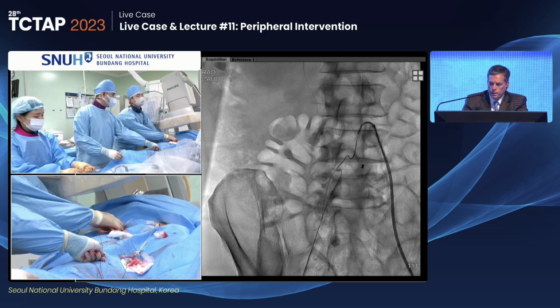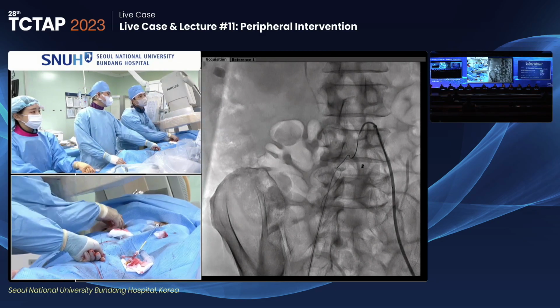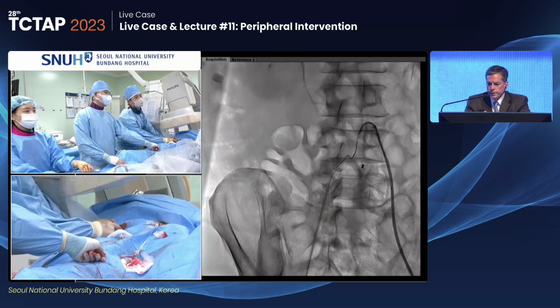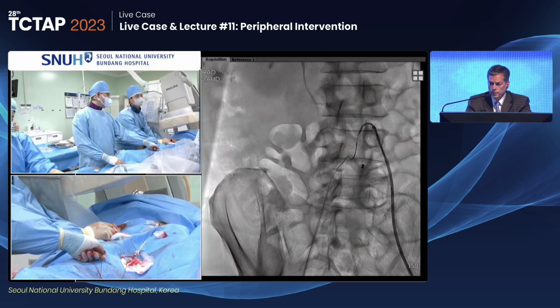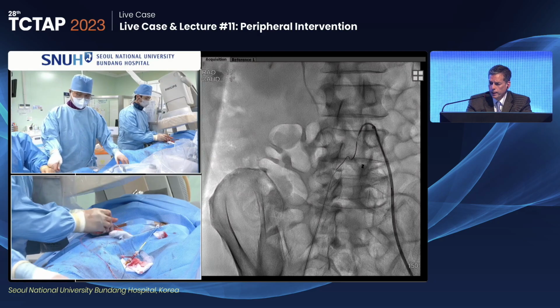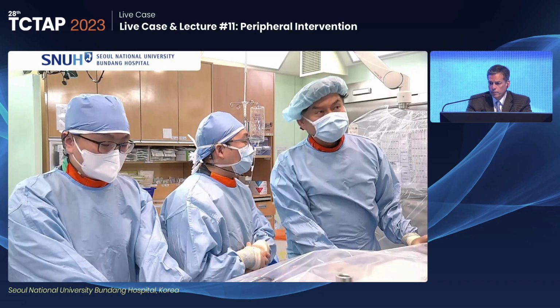So Lawrence, assuming we get this artery opened up, what would be your preference from a stent standpoint, covered or uncovered here? I kind of like the idea of IVUS here, just to make sure I'm not too adventitial, but I tend to believe that I would do a stent graft from the origin down. I don't think you have to cover the internal iliac. I don't think you're going to be near it, but I think that would probably be the easiest answer.